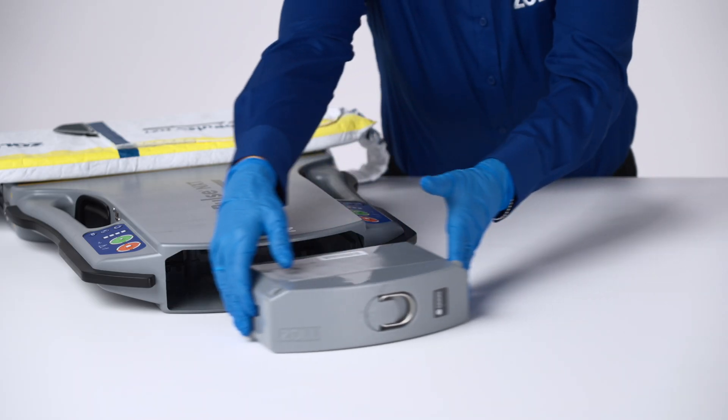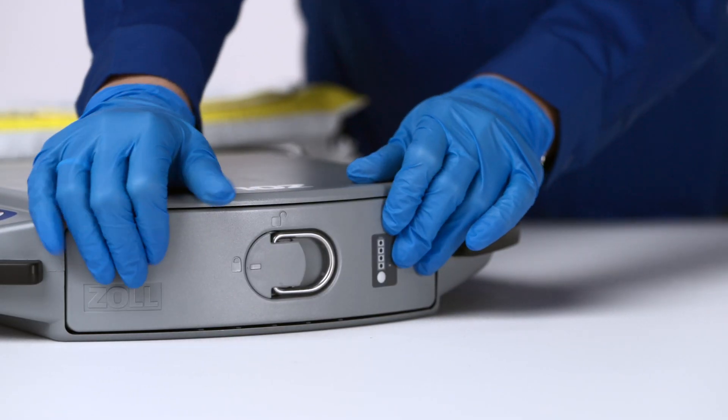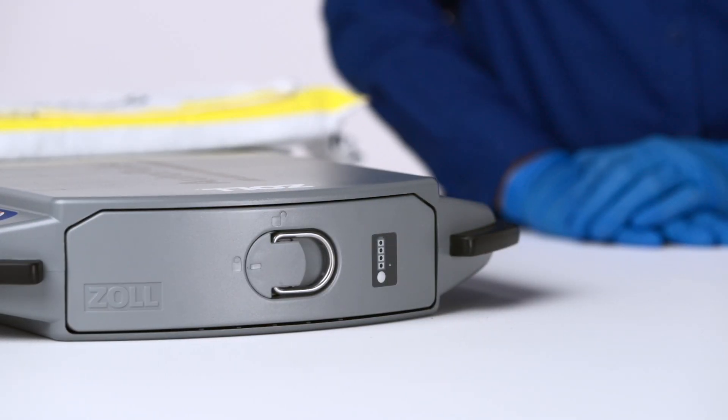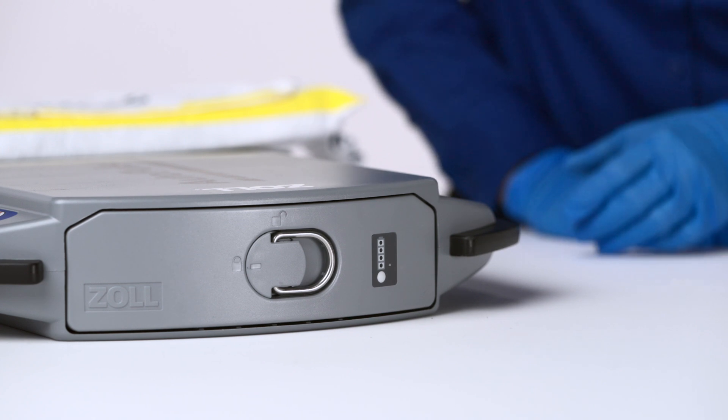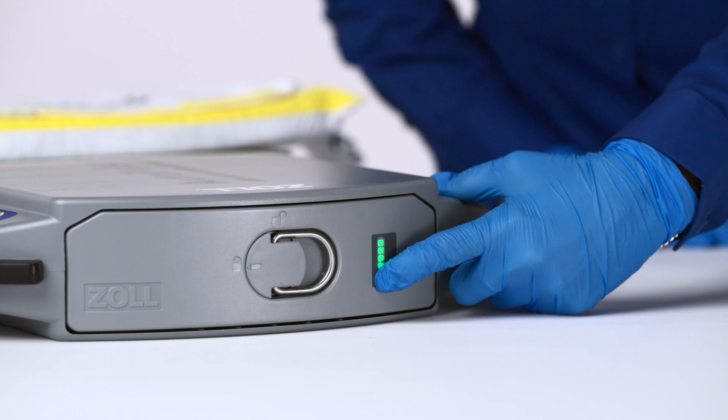Slide the battery into the compartment. It should snap into place, flush with the platform. To check the battery status in the AutoPulse NXT platform, press Status Check to view the battery charge level.